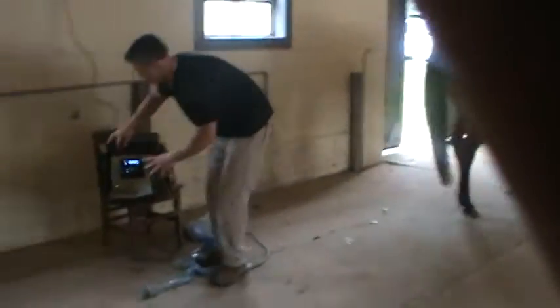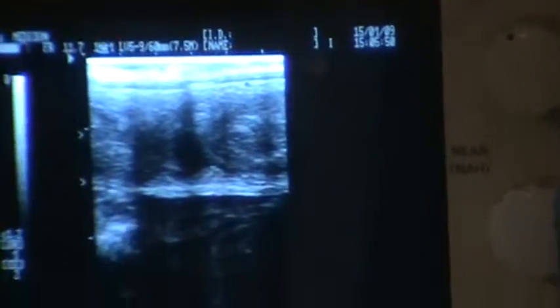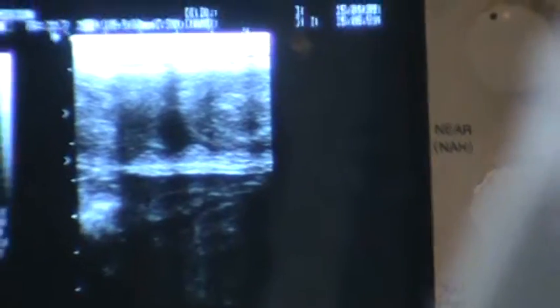Okay, freeze that. Okay, so you can move her on back. Thank you. So one of the interesting things about this mare, y'all can come up if you want to. We are looking at her uterus. This line here that's linear in this direction is the bottom, and then this is the top of her uterus here. And you can see that there's a little tiny dot in the center of that uterus. That's abnormal. We don't want that to be there. That's fluid that's in her uterus. If we saw that structure on an ovary, we would just assume that that's a follicle and that's great, that's hunky-dory. But fluid inside her uterus is a bad thing. That's an indication that either A, there's an infection, B, this could be a cyst, or C, there could be some fibrosis or scarring in her uterus. Any of those things are bad for fertility, okay?